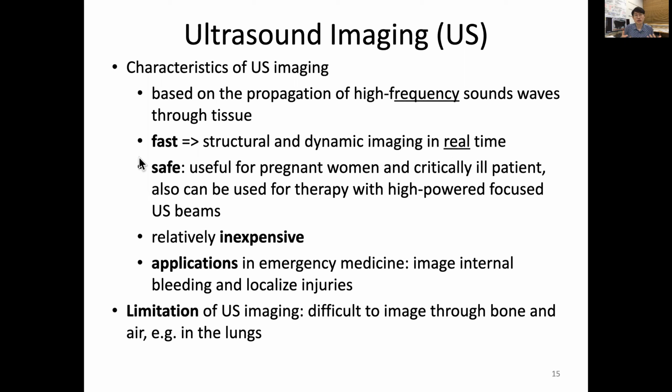Unlike the X-rays and CT I discussed before, which use ionizing radiation, now we are talking about sound waves and ultrasound. So that is non-ionizing radiation. This is safe so that we can use it for pregnant women. You remember, for pregnant women to see the child inside the belly, and also for critically ill patients.